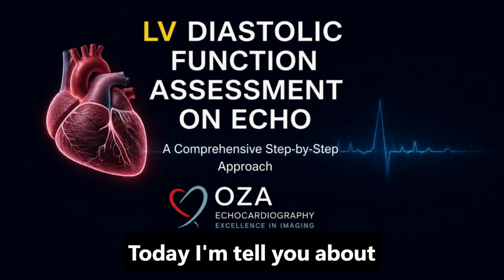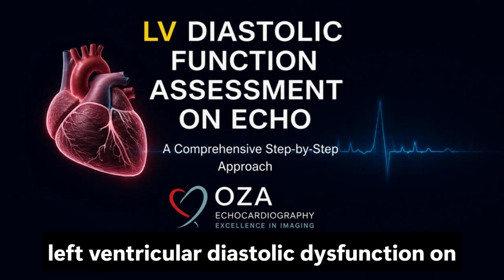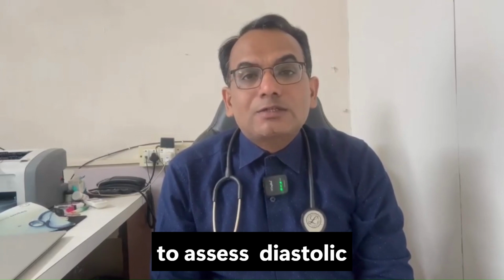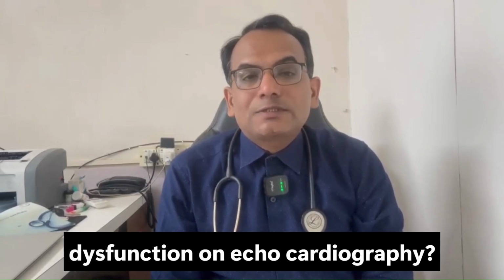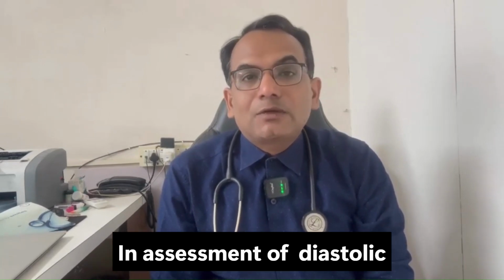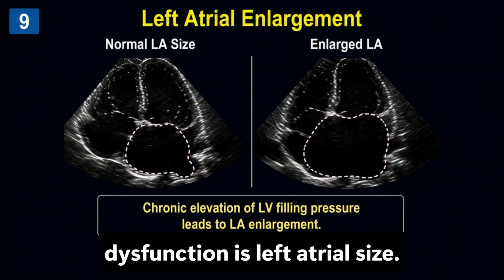Today I am going to tell you about left ventricular diastolic dysfunction on echocardiography. How to assess diastolic dysfunction on echocardiography. The most important part in assessment of LV diastolic dysfunction is left atrial size.